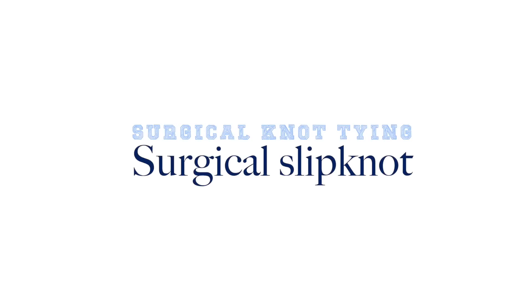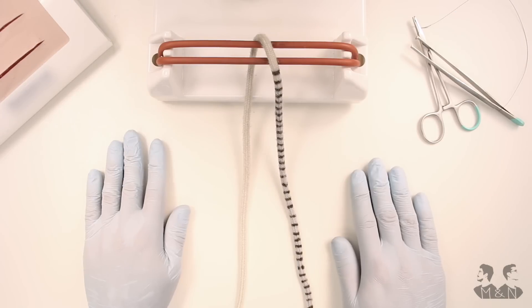In this video we are going to show you how to tie a surgical knot called the slipknot. This is how it looks like.